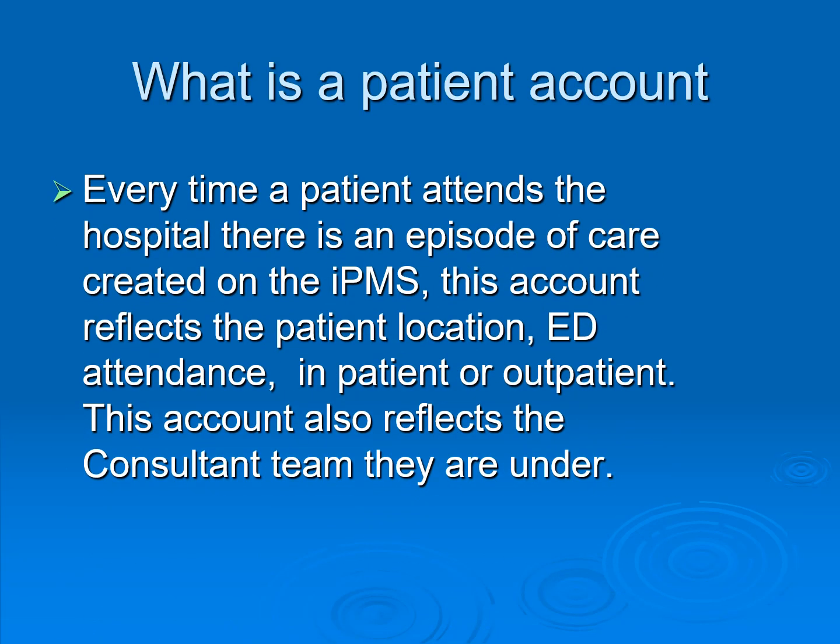Every time a patient attends the hospital, there is an episode of care created on the Integrated Patient Management System, IPMS. This episode of care or account reflects the patient's location, be that an ED attendance, an inpatient admission, or an outpatient attendance. This account also reflects the consultant team that the patient is under.